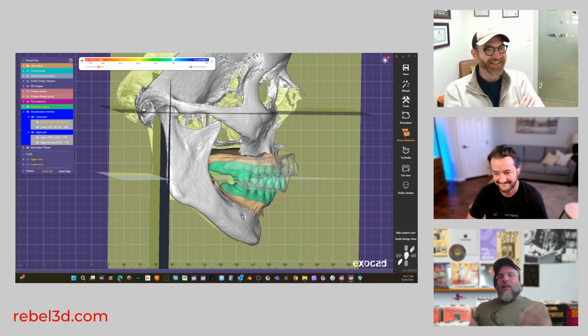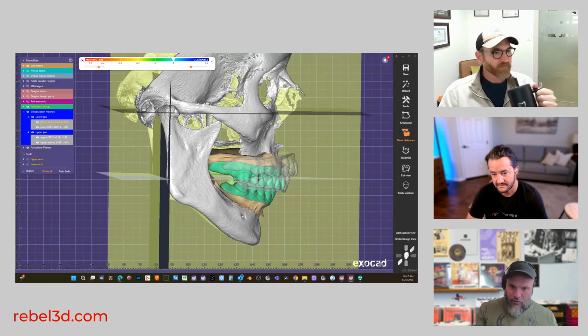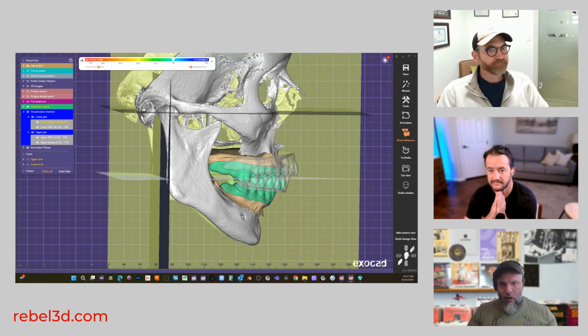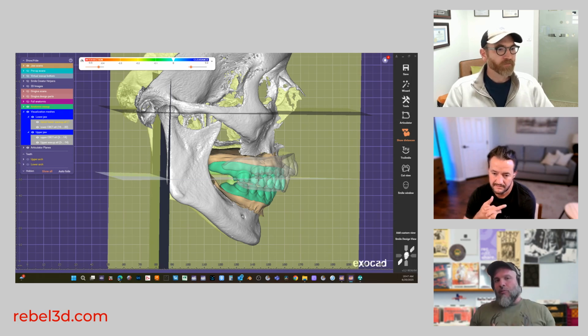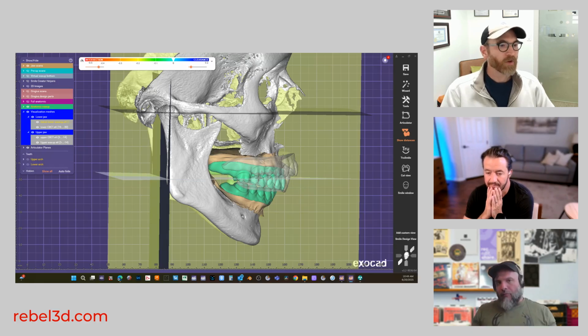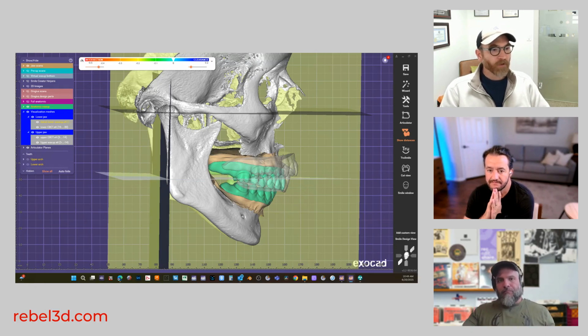Not to beat a dead horse, but I try to separate what I consider clinical decisions and technical decisions. Yeah, and the technician should never be making clinical decisions, or vice versa. So if we each take full responsibility for our part, then you shouldn't be asking me to open a bite, and I shouldn't be asking you what material I should use. We can both use our expertise and come together for an optimal result, with everyone doing what they're supposed to be doing. Yep.